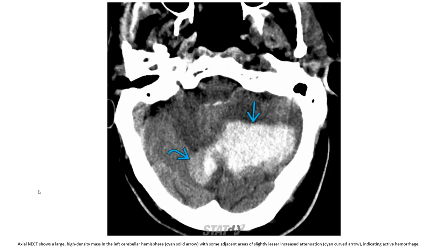Let's see the example. This is axial non-enhanced CT showing a large high-density mass in the left cerebellar hemisphere representing cerebellar hemorrhage, indicated by the solid arrow, with some adjacent area of slightly less dense signal indicated by the curved arrow, indicating active bleeding.